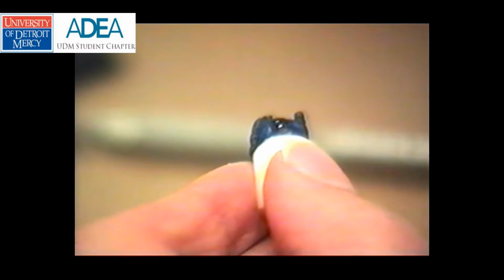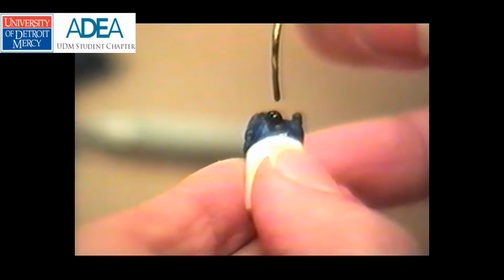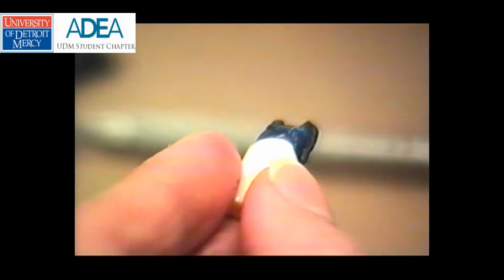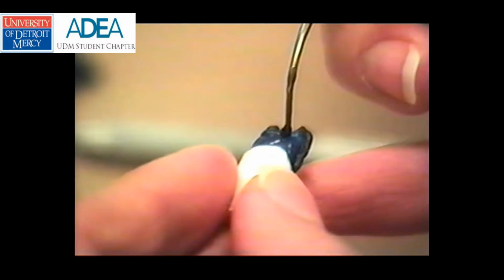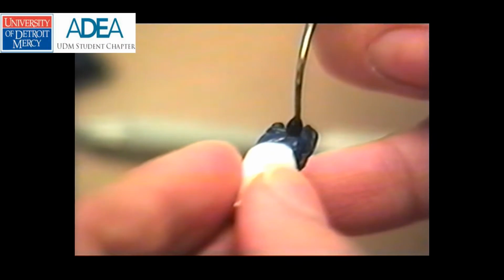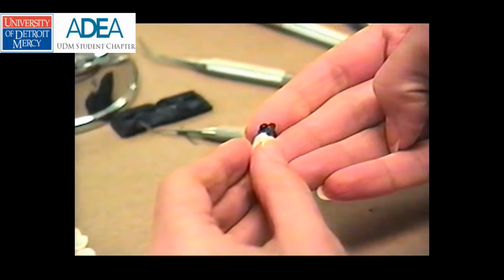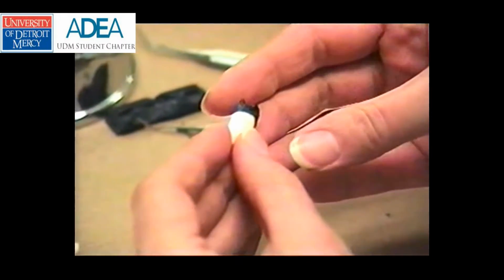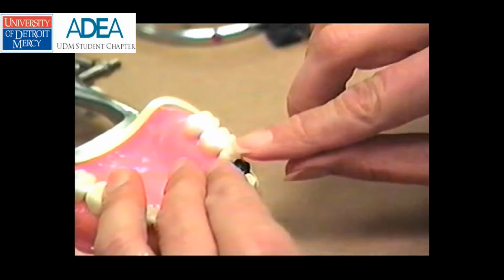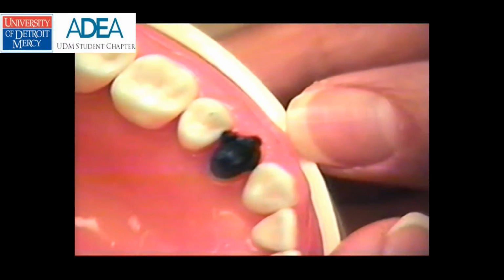Right about the area that I marked it. It doesn't have to be just right there, just so I know where I'm at, okay? So we can come in and add after. And this one's more facial, so we're going to add it here. And the facial half of the proximal surface. And then just let it cool down until it's not shiny anymore. And you can stick it in there and it's still soft. And you can see, okay, now we've got an idea of where our proximal contacts need to be.